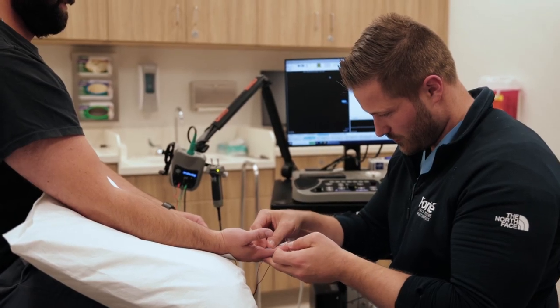The nerve conduction test is similar to an EKG. There will be stickers or leads placed on either the arm or the leg, and a small impulse will be applied to the nerve to check its speed and strength. That will be the first half of the test.